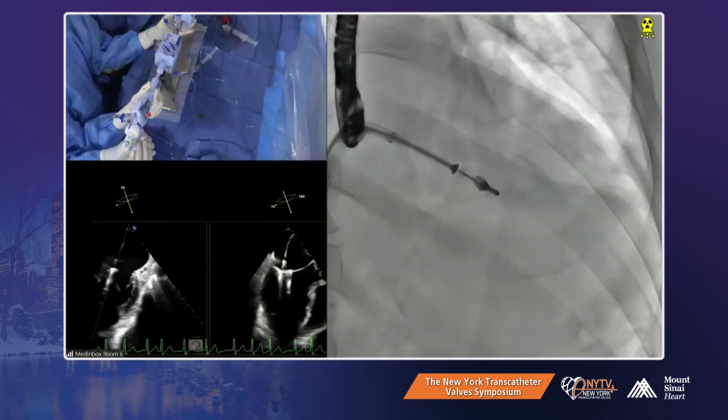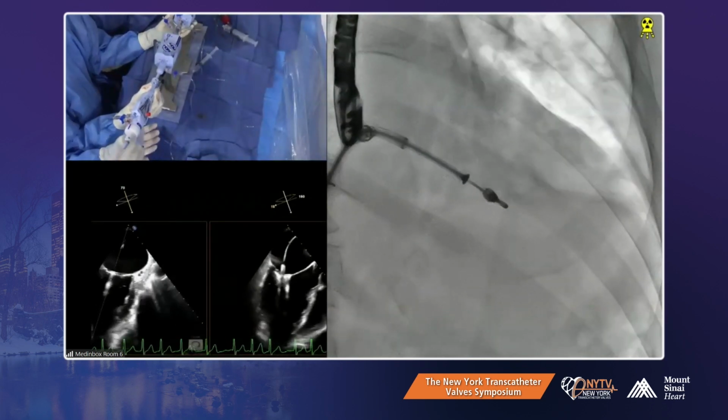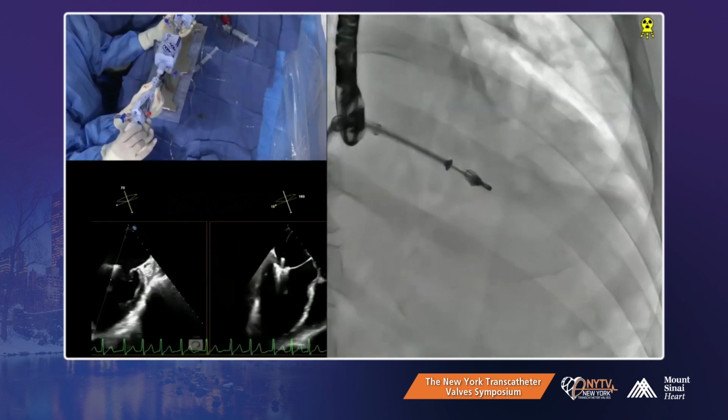Okay, right, drop. Just drop. Dropping one more time. Drop. Okay, now we see him bouncing. Okay, all right. Close, close slowly. Close slowly. No, you don't have it.